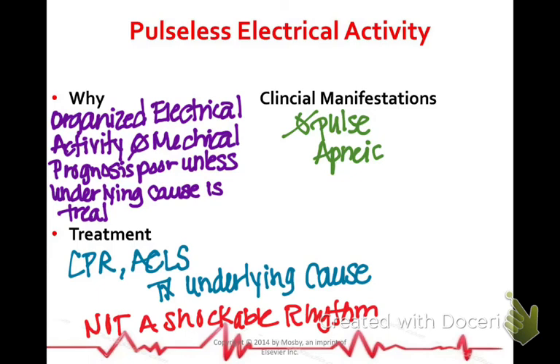And that could be anything. Pulseless electrical activity, it could look like a rhythm and they're pulseless. It can be a straight line with a few squigglies. It can be just anything. It can be pulseless electrical activity. Basically, the key there is that it's pulseless.